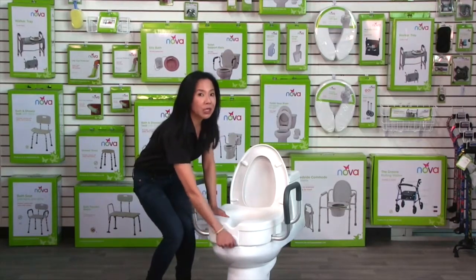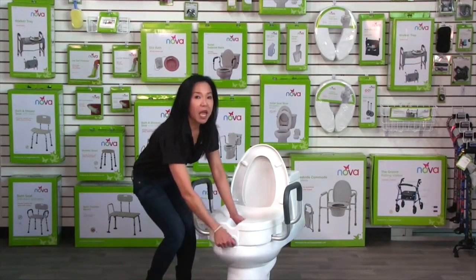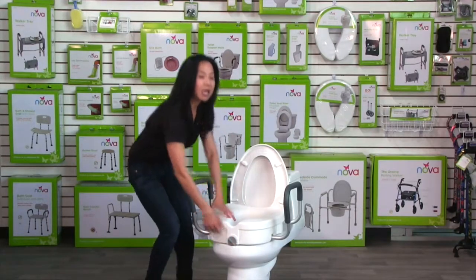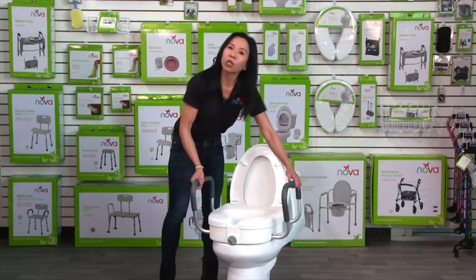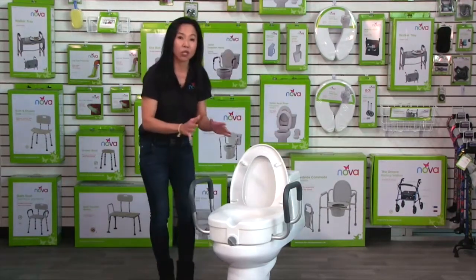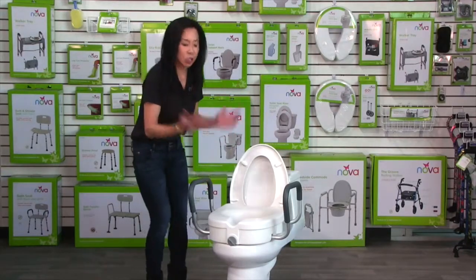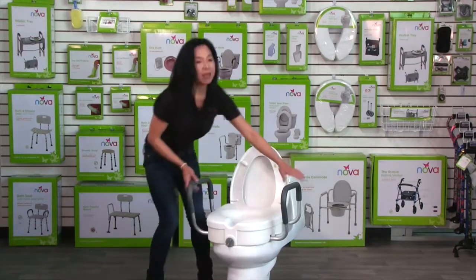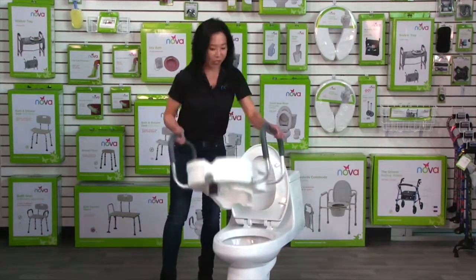All you're going to do is turn the locking knob to the right and you'll feel that pad push up against the toilet rim. Make sure it's nice and tight, and before you use it, pull up on that arm to make sure the raised toilet seat is nice and secure on your toilet. To remove it, simply turn the knob to the left and the raised toilet seat comes off easily.